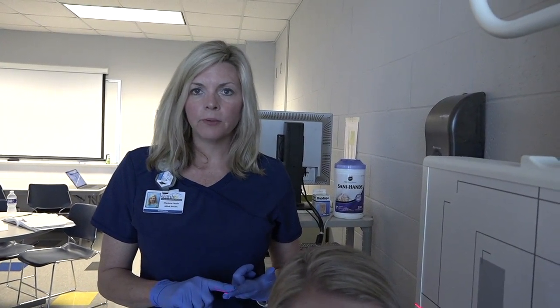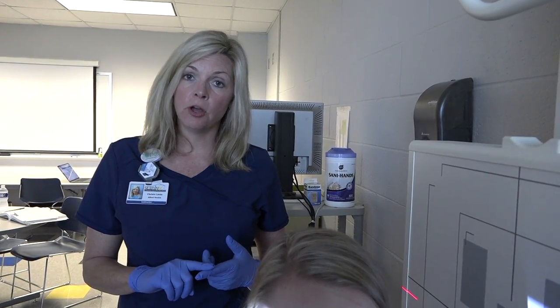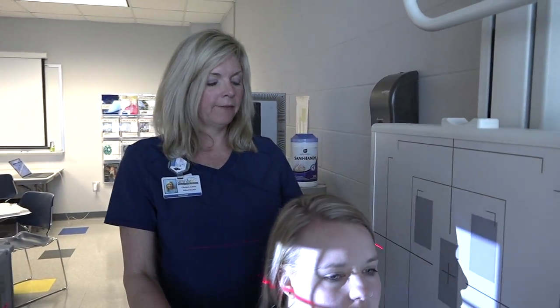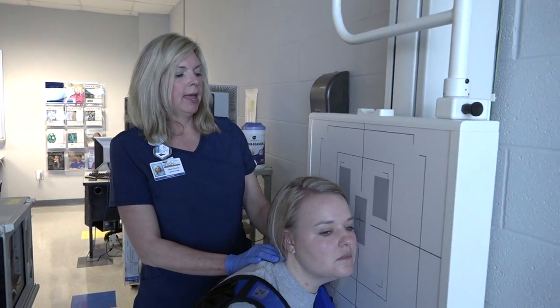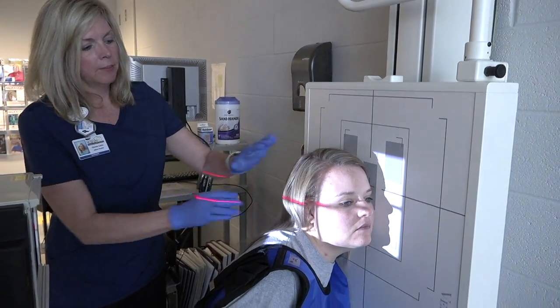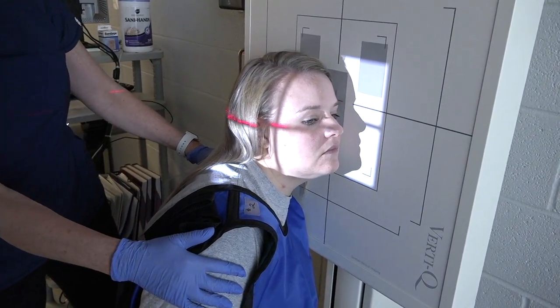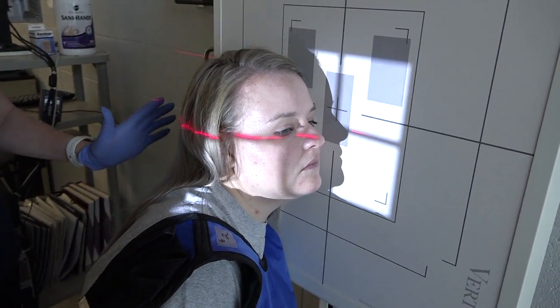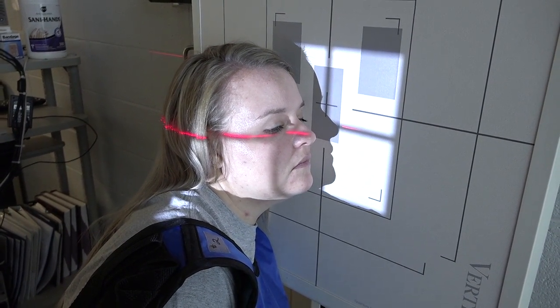Our next part of the anatomy is our nasal bones. We'll do the right and left lateral and then the Waters — those are the three positions you'll need to know for the nasal bones. You'll have the patient turn their shoulders and get into a lateral position, but you're just focusing on the nasal bones. The centering is a half inch below the nasion.